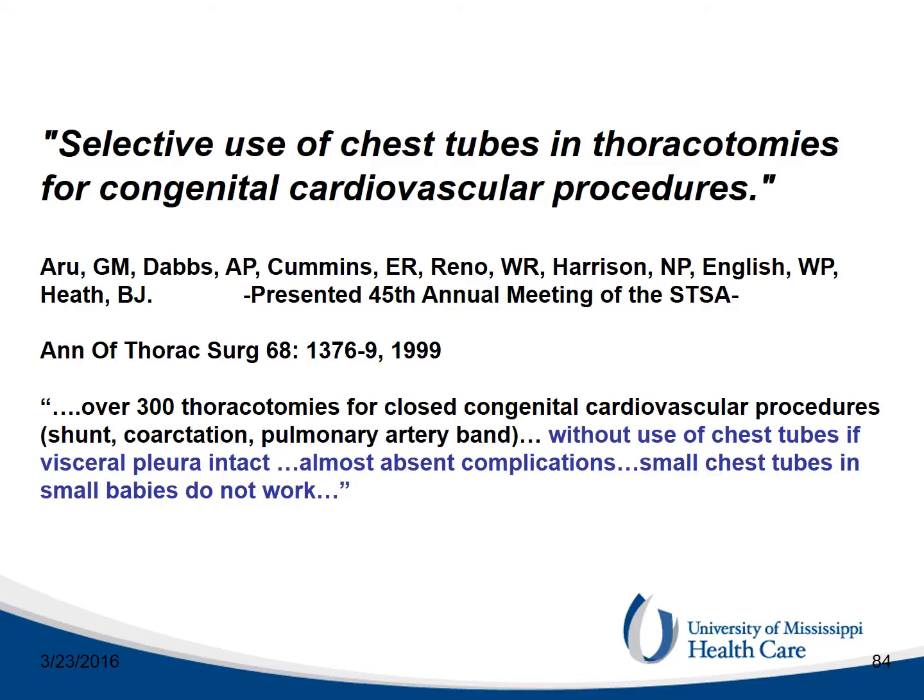Simple congenital cardiovascular procedures done through small thoracotomies in babies can be performed without the use of chest tubes. In fact, small chest tubes have a great tendency to clot, kink, and become non-functional.